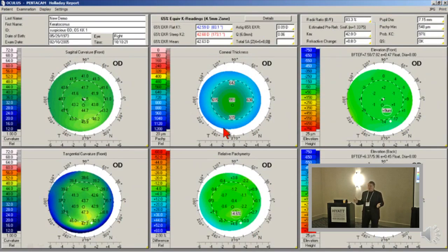Okay? Green is normal. Blue colors are in the direction of the cool colors, and blue are basically things that are a little better than average. And orange, yellow, orange, and towards the red end of the spectrum, the warm colors are bad. So when you see red, you know you have a problem. When you see blue or green, you know the patient's good. So you look at this exam and you say, what? Everything's green, it's absolutely normal.